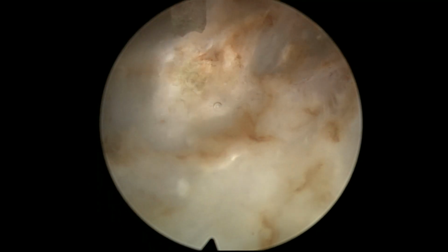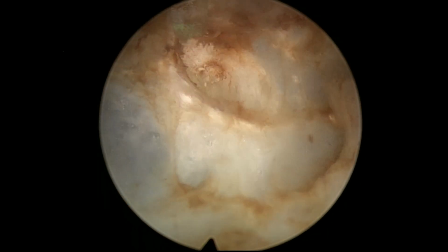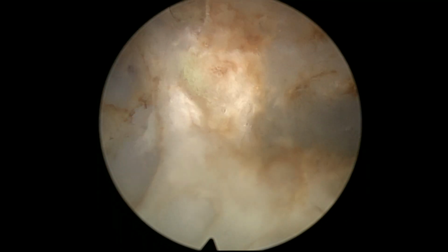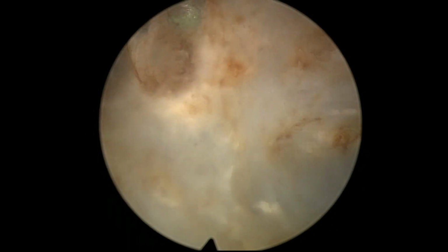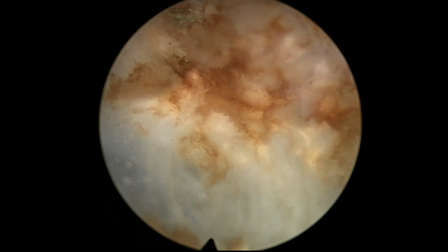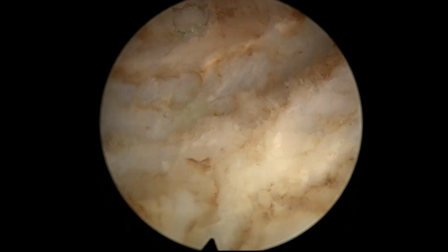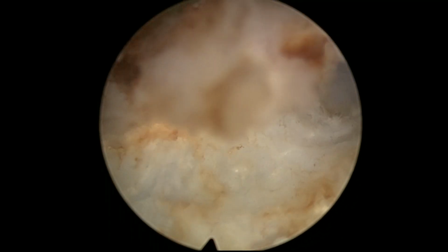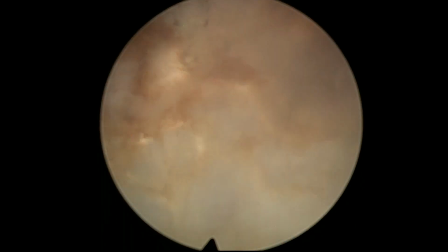But of course, we have the experience in the operating room. Also, you know, these fibers degrade very fast, and probably the physical properties of the laser coming out of the fiber change very fast when the fiber degrades. But we keep working, and we keep using this energy. We cannot stop every 2 minutes to cut the fiber and continue. So we have to adapt.